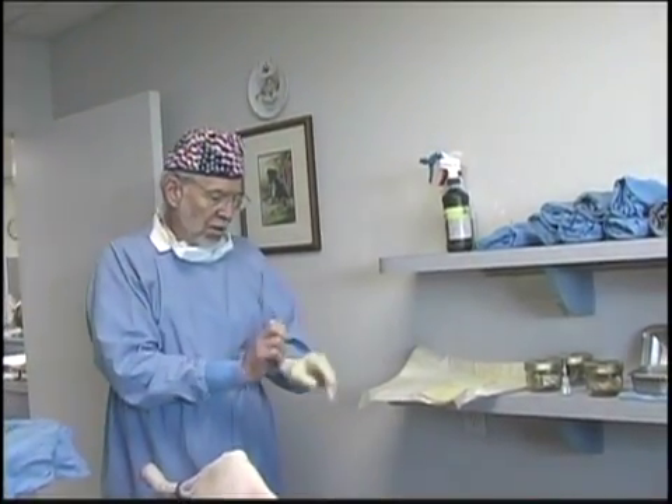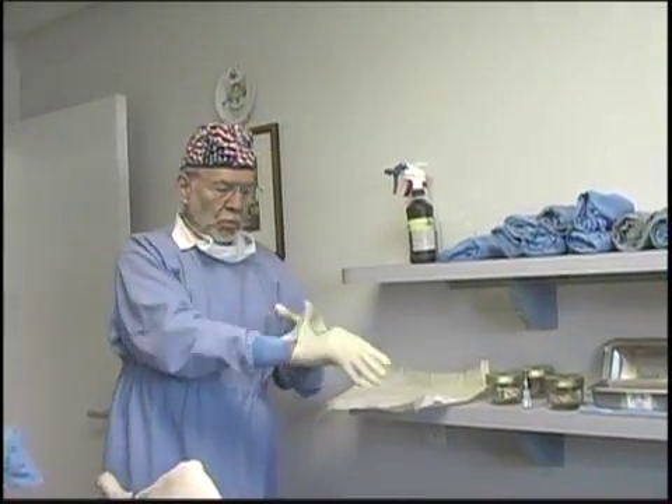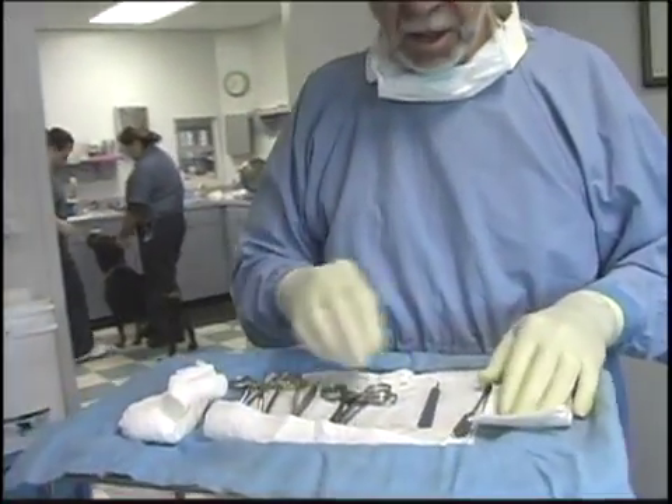Our gloves — we've actually reused the gloves, re-autoclaved them. With care, they'll go for a number of different times. The surgery pack has a total of eight instruments in it.